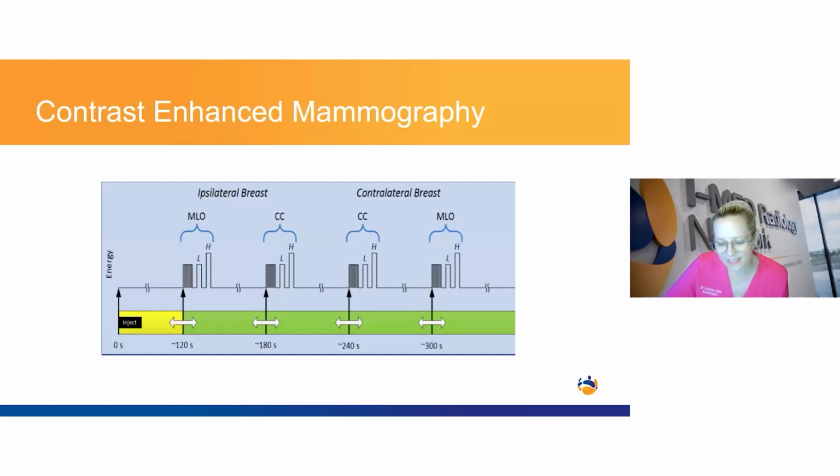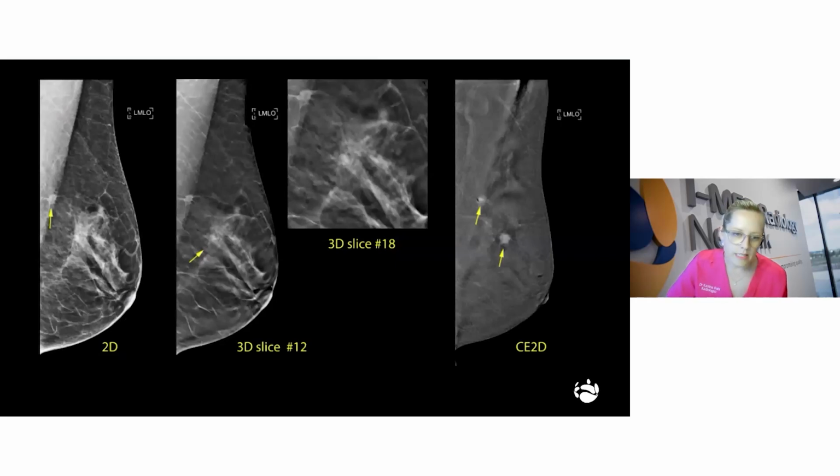Every time we roll out to a new clinic, the mammographers are concerned about how long they're going to take their images. And once they're settled in and thinking about it, we have plenty of time. And often we do have time at the end to do some additional images if there is an abnormal finding. So our mammographers are getting increasingly experienced and achieve this in a very short amount of time. Here is another study, just because pictures are nice and you're at a radiology discussion.